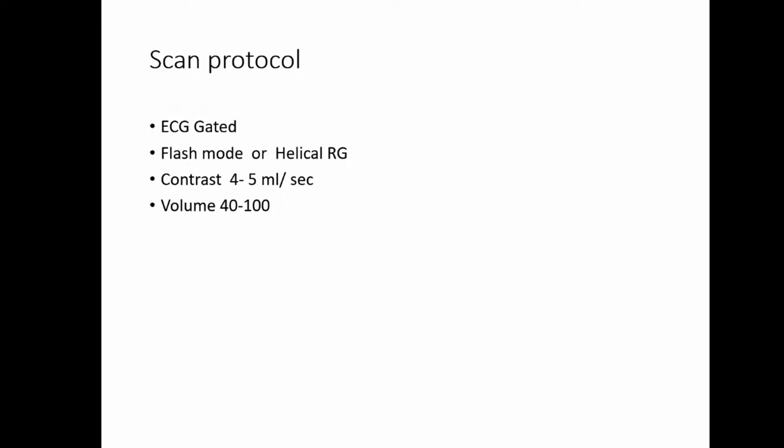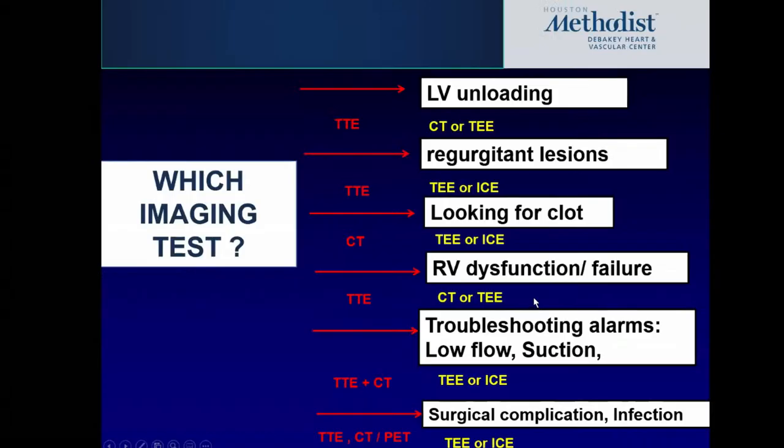We don't use beta blocker in this patient. And up to a creatinine clearance of 45, we usually will perform the scan; less than that, it's a question that needs to be answered with CT. We prefer not to give contrast in patients with CKD 3 or higher.